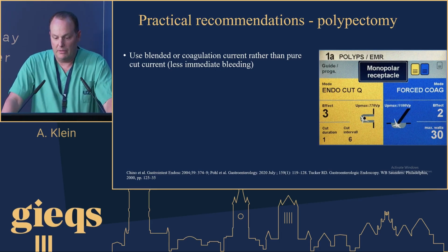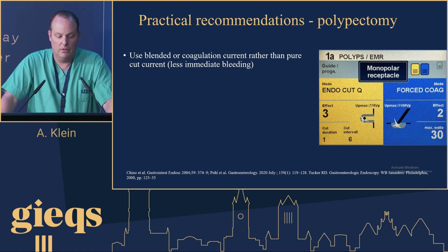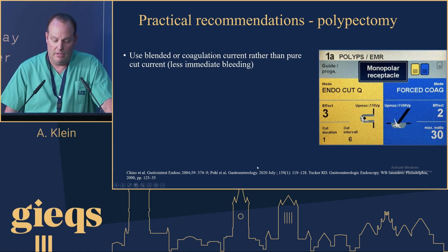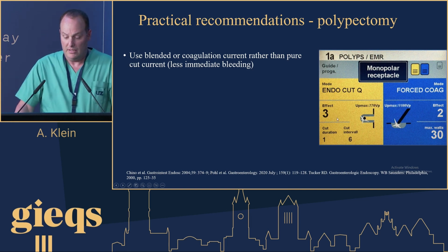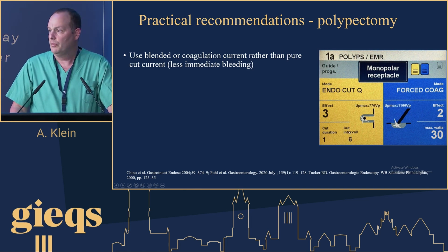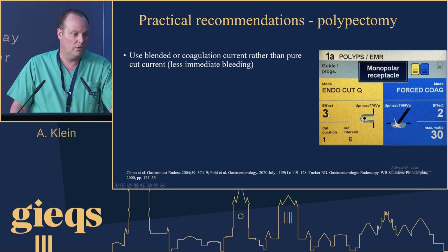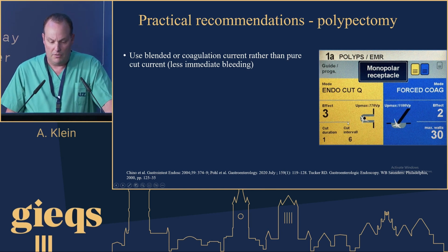So some practical recommendations for polypectomy. You can use a blended current such as Endocut Q. You can get a cut duration which you can change, but usually this is the standard per setting, and your intervals will be shown here. And in between the cutting and the next cutting, during the interval, you will get the coagulation effect that you can also change here on the device.